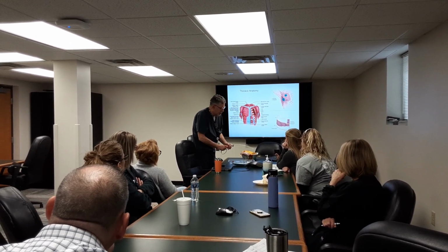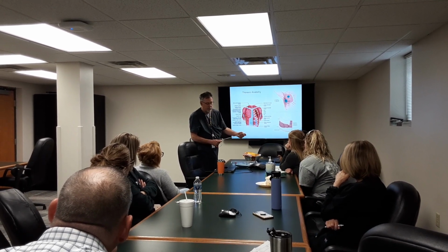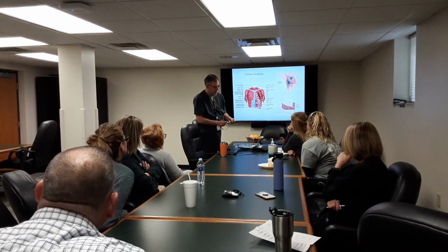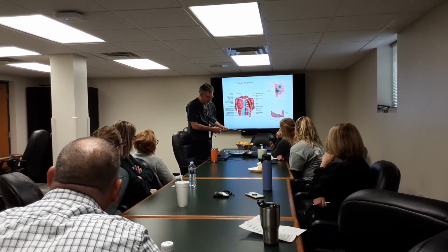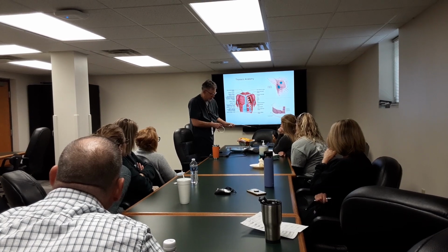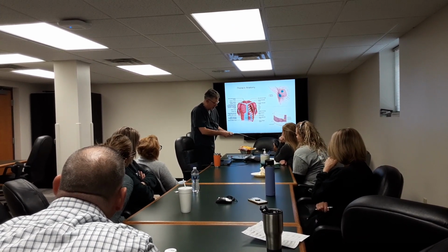And it passes a little bit rough right there, just like somebody else said, because of that little tip, it kind of has to bend across. And so once we got that out, then this will go in. We want to be able to control the wire at all times. So then this will come out.